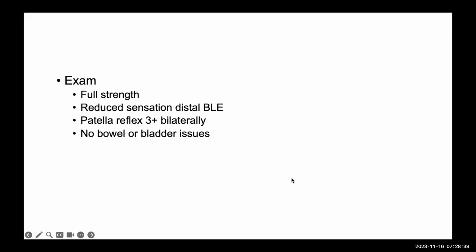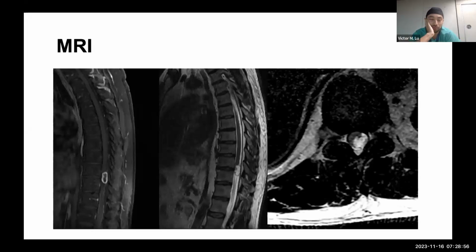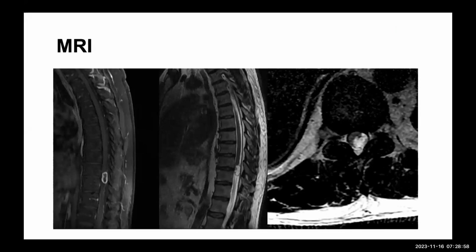Yeah, I guess I'd be worried about some kind of lesion in his spinal cord. But probably want to get an MRI. There's some sequences here for you. All right. So sagittal MRI, post contrast. Looks like there's a thoracic lesion, contrast enhancing.